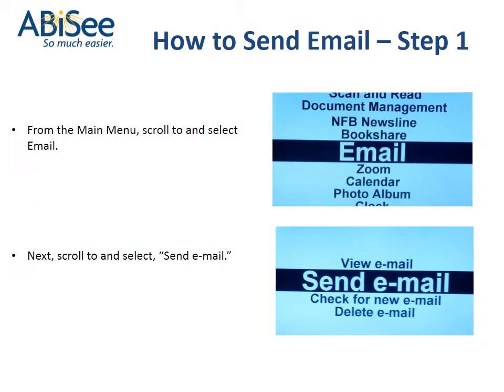How to send email. Step 1. From the main menu, scroll to and select Email. Next, scroll to and select Send Email.